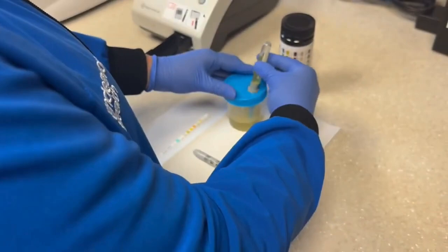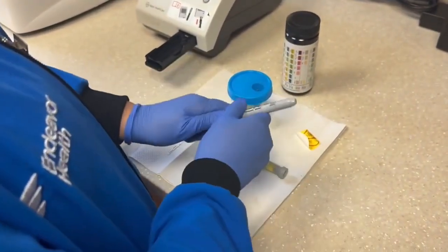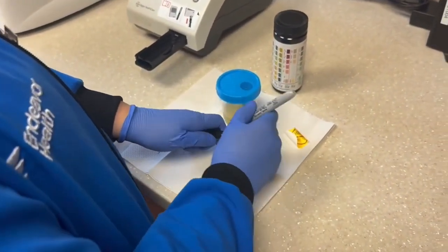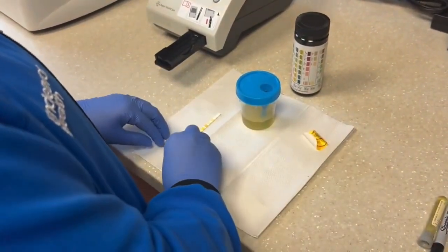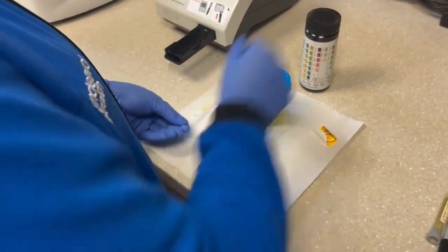Once the culture has been collected, we'll label the urine culture tube with two patient identifiers. Before dipping the strip into the urine, we'll visually inspect it to ensure that no color distortion has occurred.